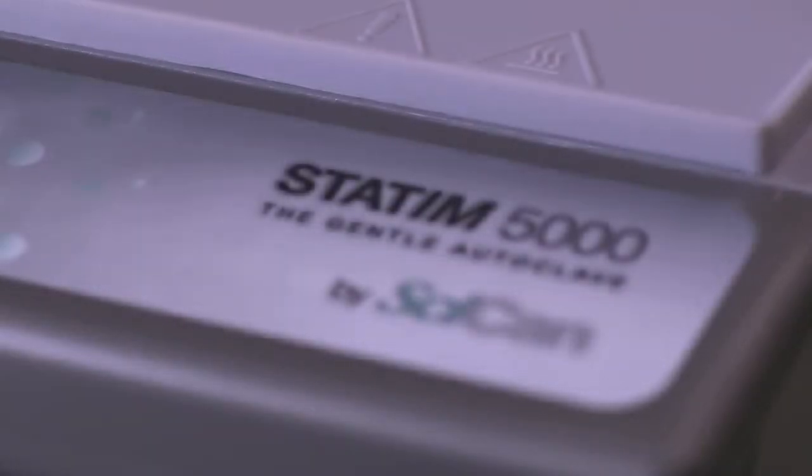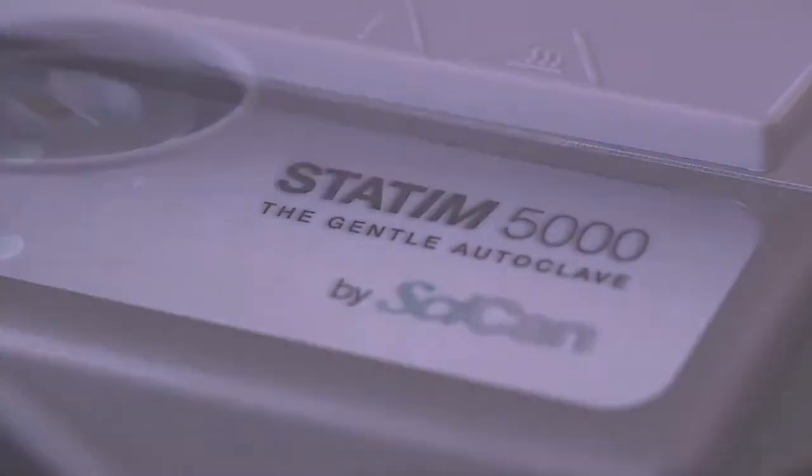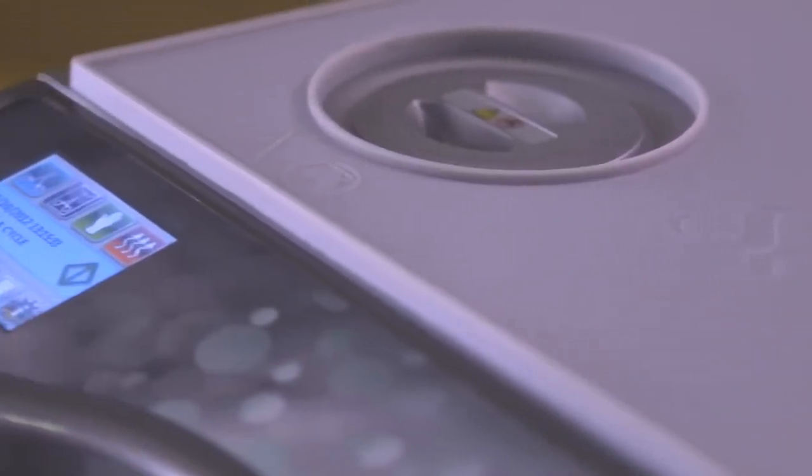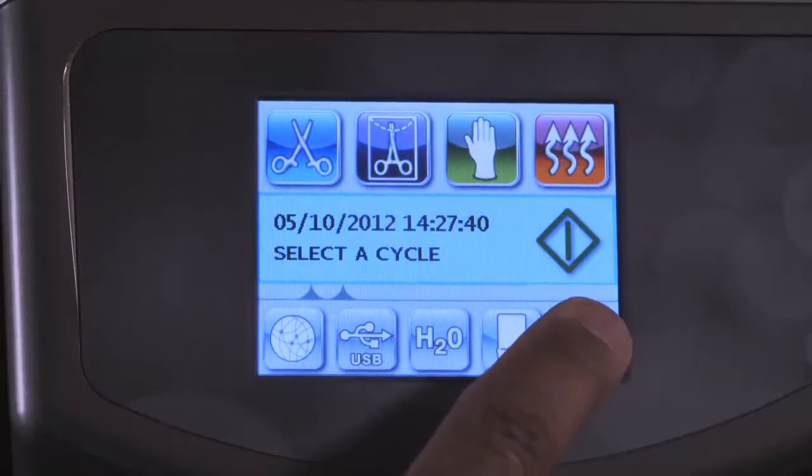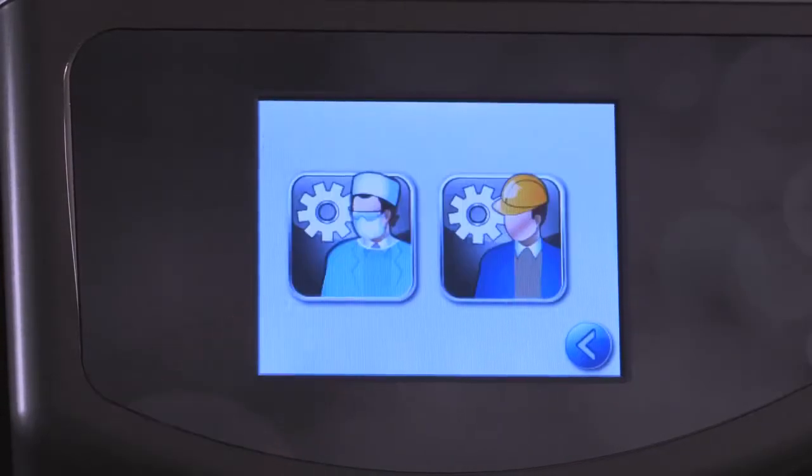Connectivity that brings you unprecedented real-time support, data collection and logging, and off-site data storage — all easily accessed via a new touchscreen interface. This, in addition to the same leading features our customers have always trusted for over 20 years.